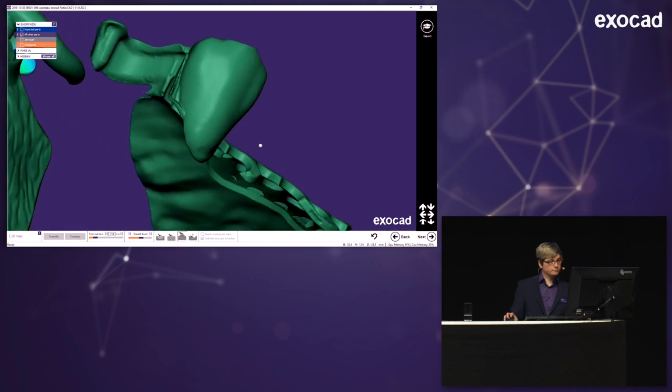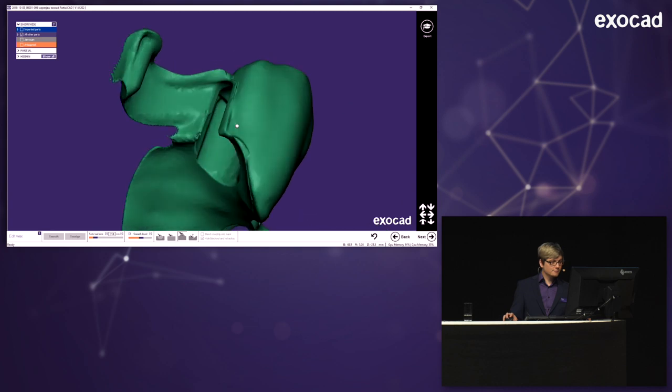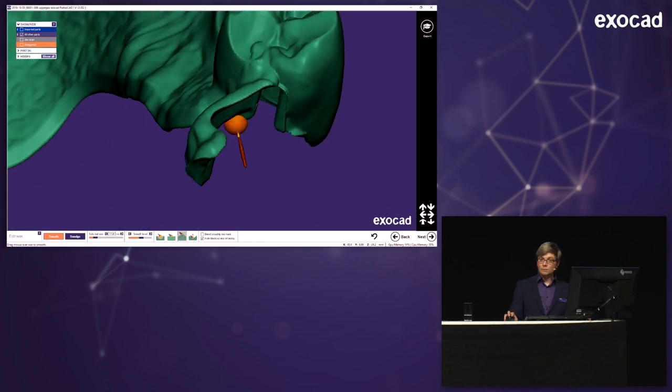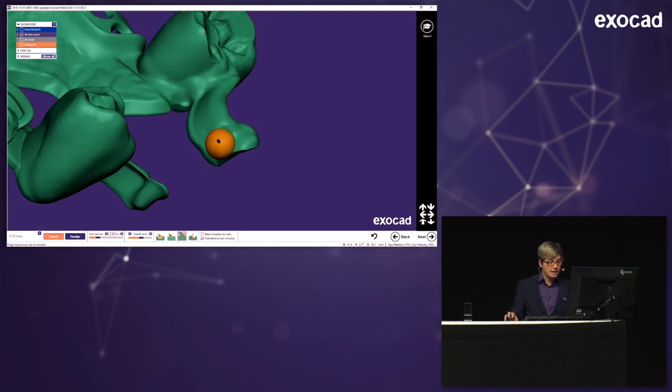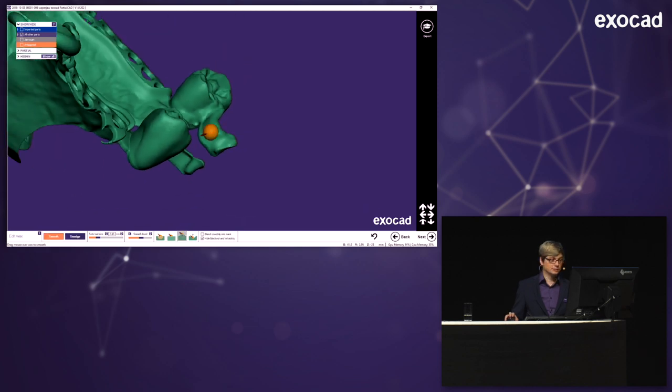Same here. And this is actually one of the big positives of the software. You could never do this in real life. If you had a model where you worked and used wax to actually design your partial framework, you would never be able to correct all those parts here before casting it.